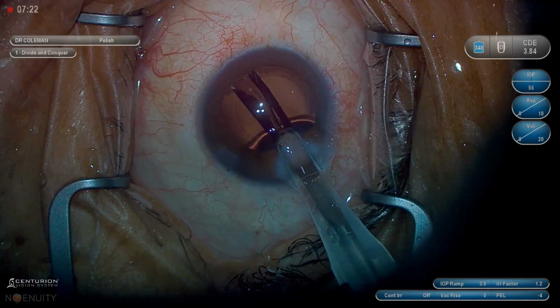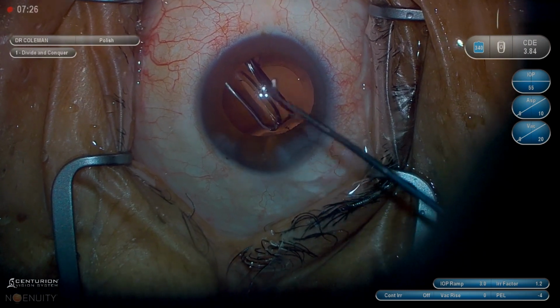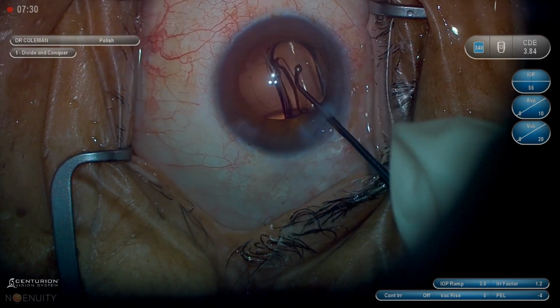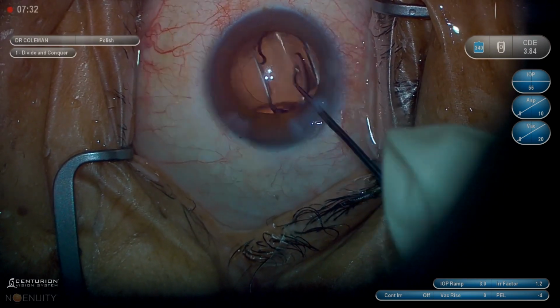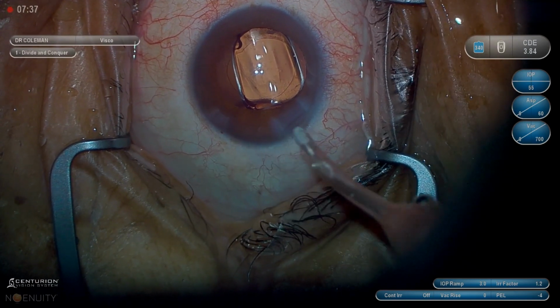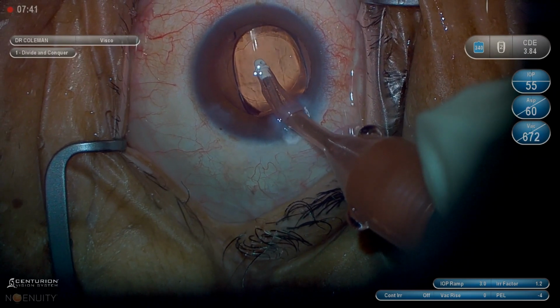Remember, it's going to go clockwise, whichever way it's loaded. It should be loaded facing up, rolled up like a taco. Sometimes it's not. Be aware, you can rotate if you have to. And if you're using silicone lenses, light adjustable lenses, or 3-piece lenses, they come out in more of an explosion rather than a controlled way like a single-piece lens. So sometimes a lot more rotation is required.